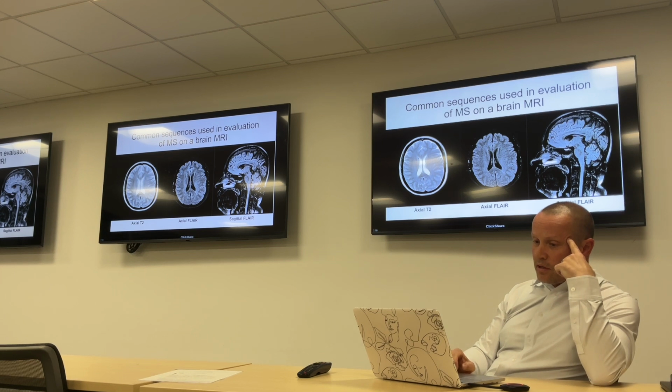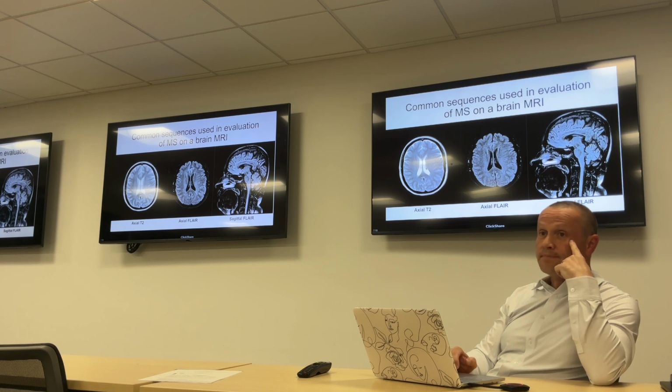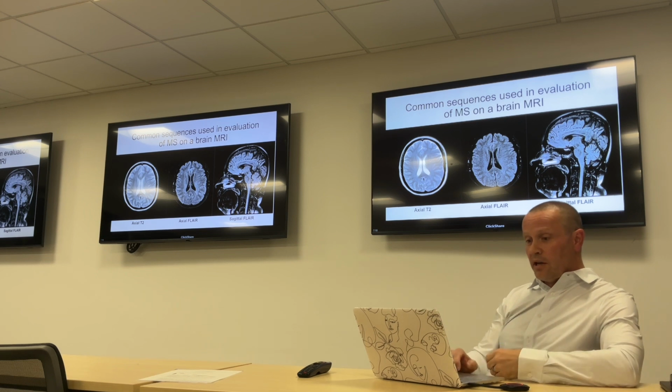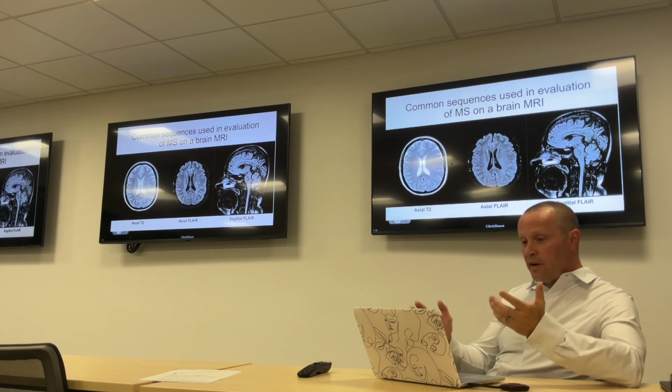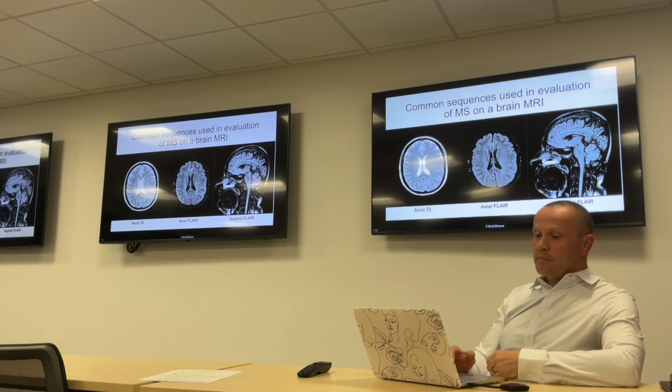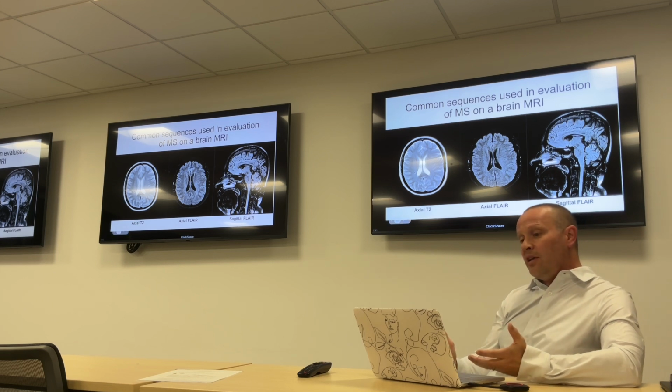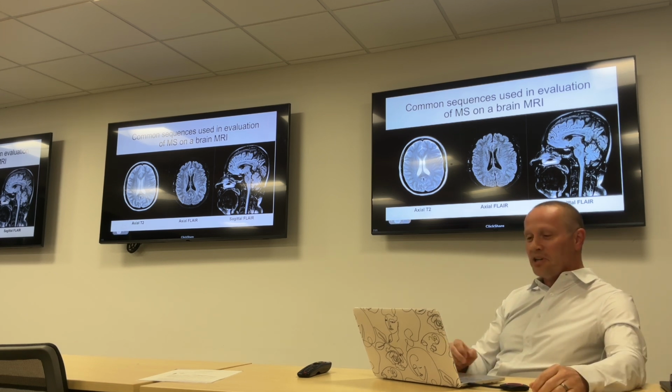This is how we determine whether a brain is atrophic or atrophied: by looking at the difference between the amount of brain tissue versus the amount of fluid inside the skull. When you've read 8 million of these things like I have, it comes pretty quickly. You glance at it and say, oh, this patient should be about 45, 50 years old. If they turned out to be 20 years old, I'd be worried. I'd say something's wrong, they have more atrophy in their brain than they should. If they're 80 years old, I'd say they've done a great job. Whatever they did, they did it right.